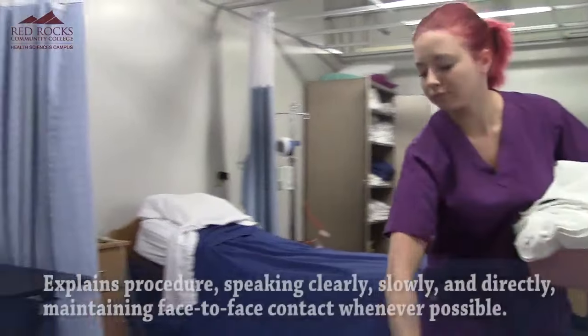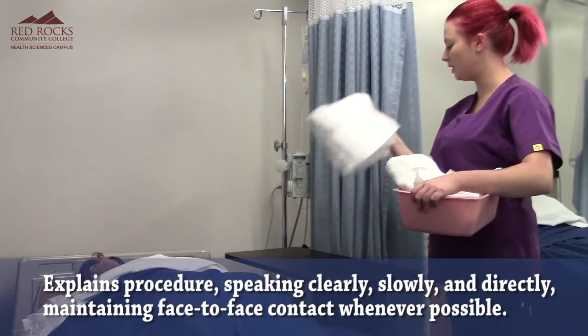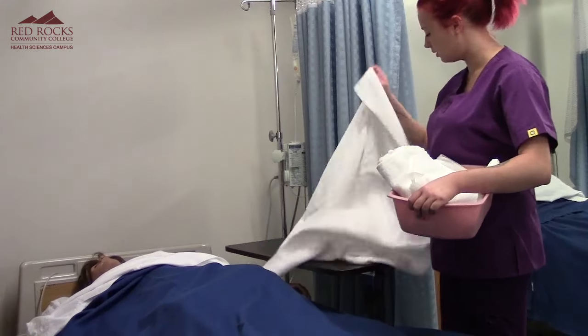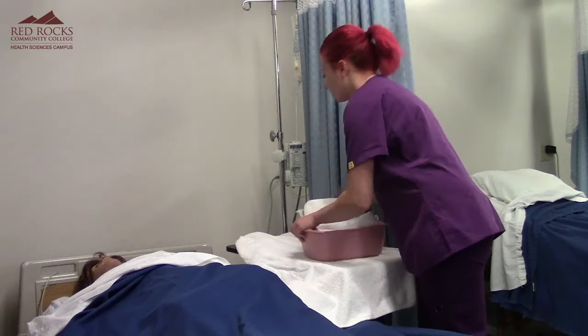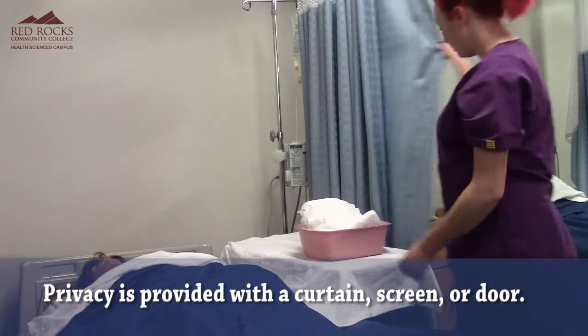I've already washed my hands. Hi Mary, my name is Shelby. I'm going to be your CNA today, and we are going to give you some catheter care. So I'm going to get my protective barrier on the table and provide you with some privacy.